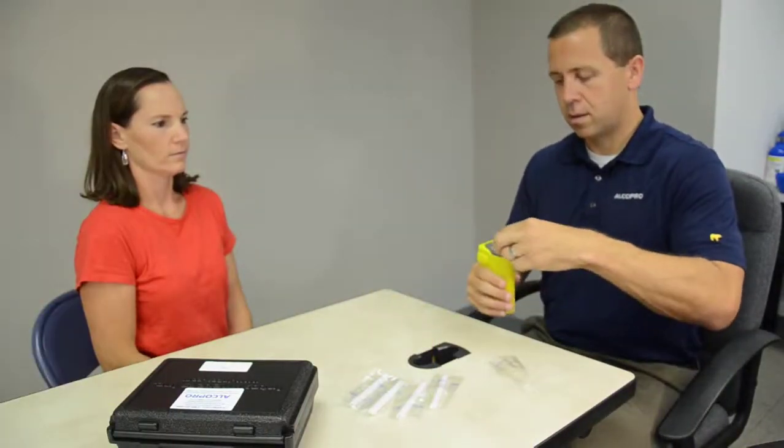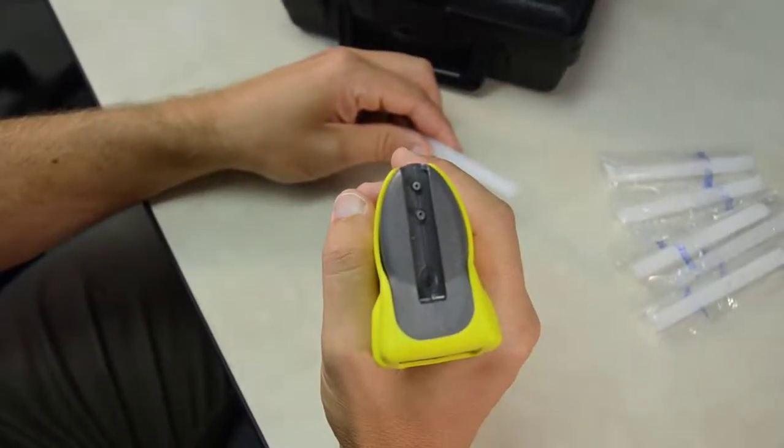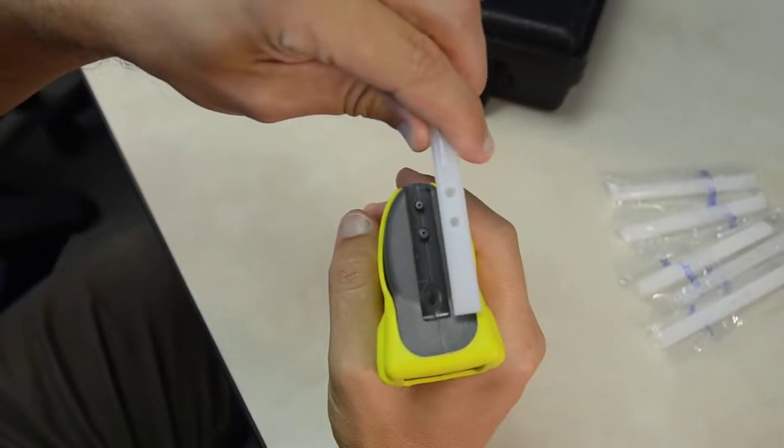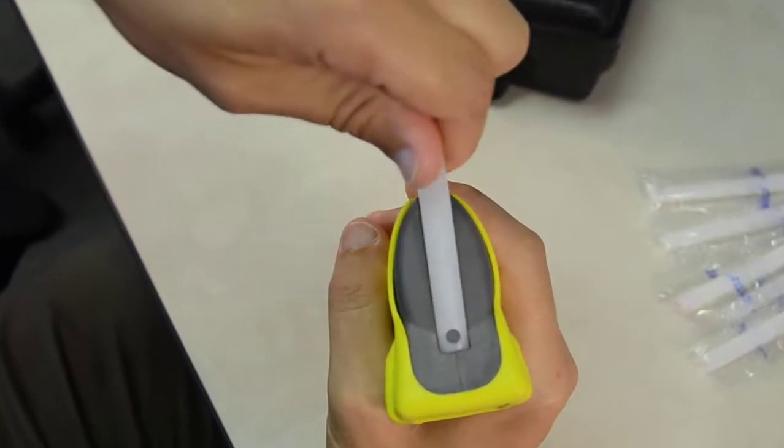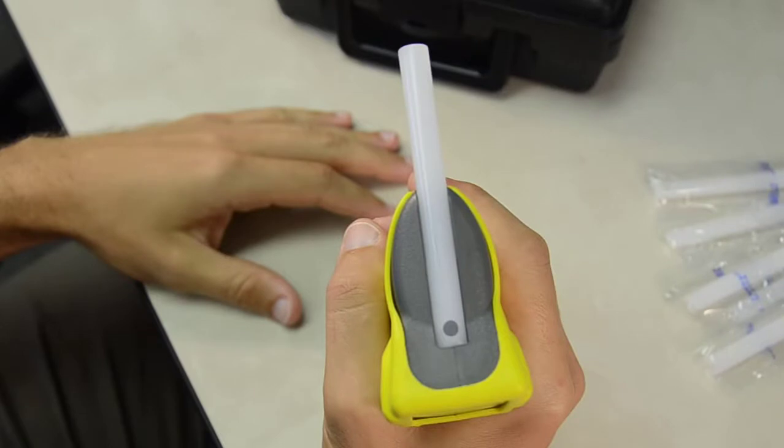To initiate a test, use a clean mouthpiece. Insert the long, closed end of the mouthpiece into the mouthpiece channel located at the top of the instrument. Rotate the mouthpiece down and the two small holes along the bottom of the mouthpiece will snap onto the two breath inlet ports inside of the channel.